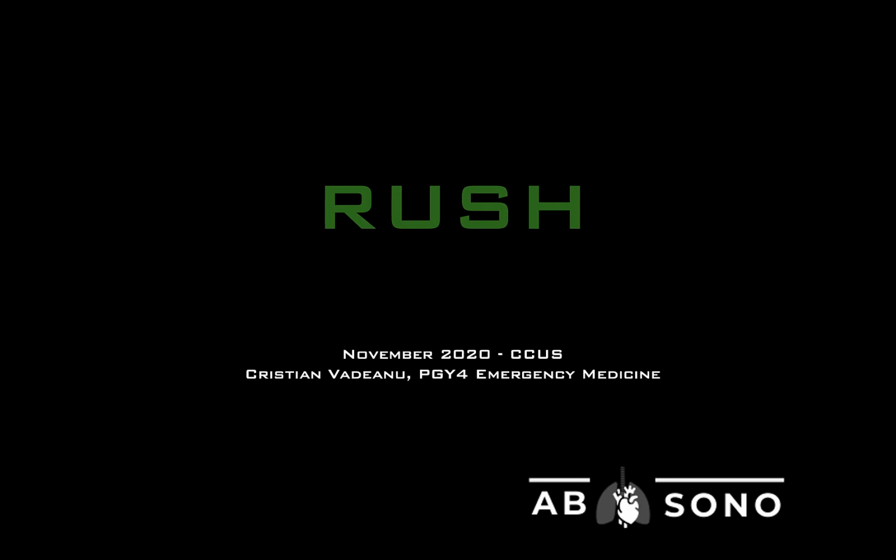For the next 15 or so minutes, I will be giving a brief tutorial on the RUSH exam, one that you will hopefully find useful in your management of the undifferentiated patient in the critical care setting.